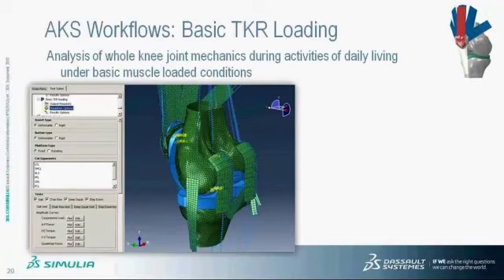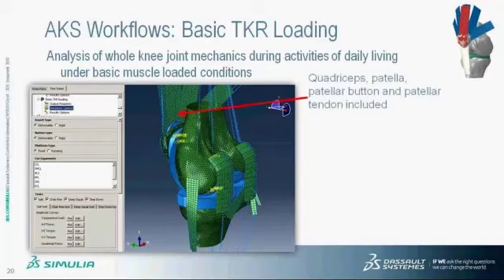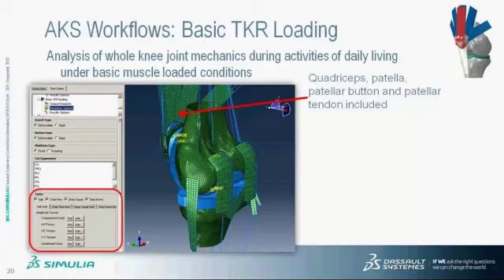Finally is the last workflow in Abaqus Knee Simulator. This is the most complex workflow. It is the basic total knee replacement loading workflow. This is the analysis of whole joint mechanics during activities of daily living under basic muscle-loaded conditions. Compared with the tibiofemoral constraint workflow, additional muscle and bone and the soft tissues are included.